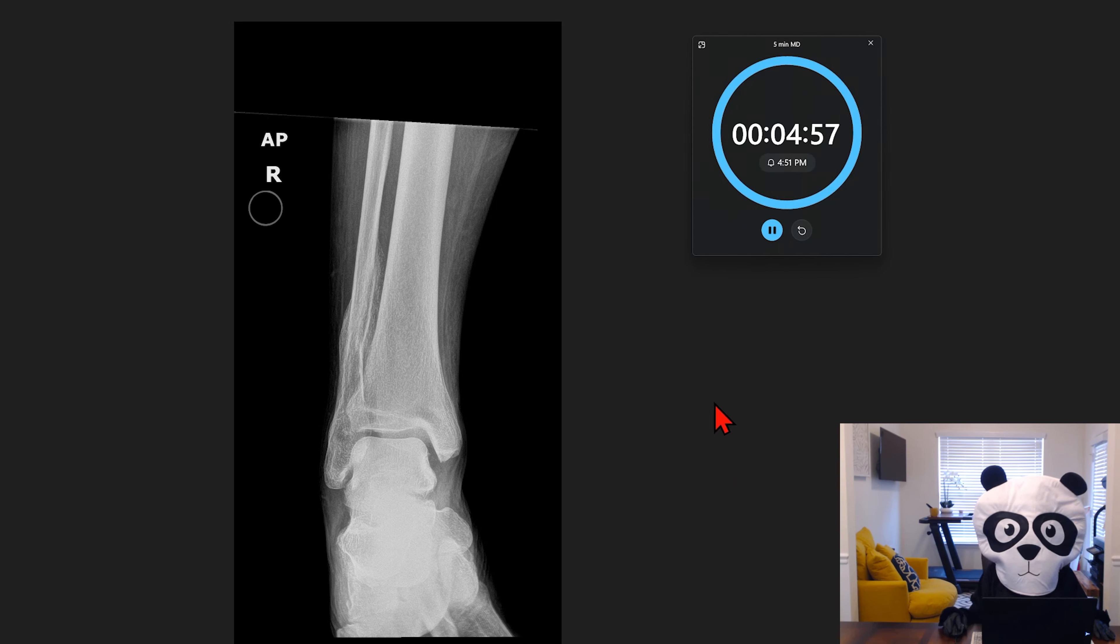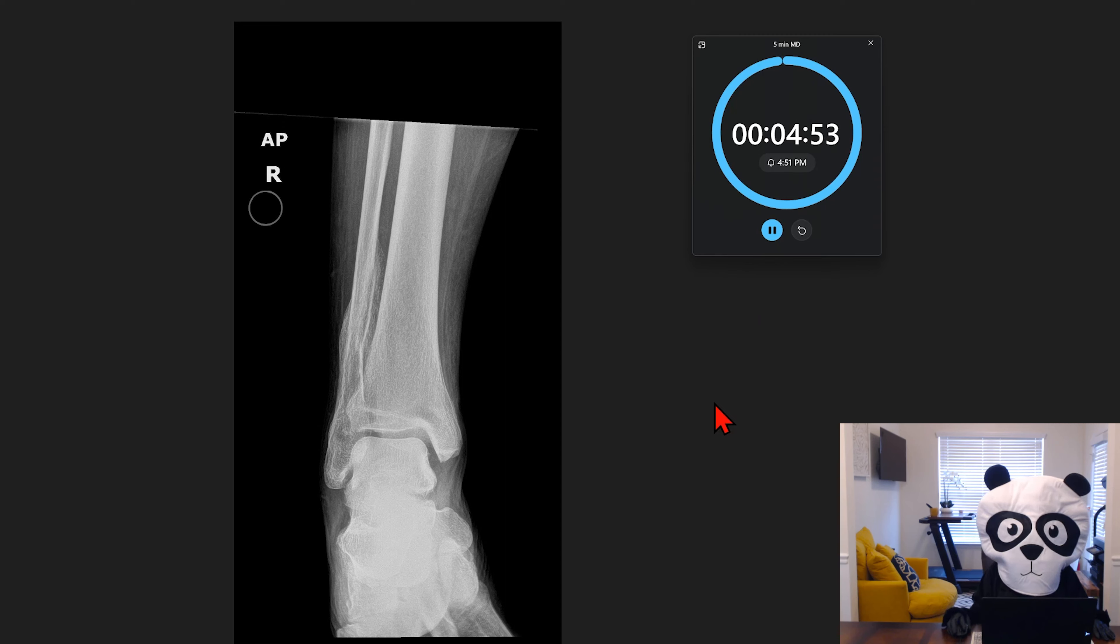So the backstory on this exam is this patient fell down a set of stairs and came in complaining of right ankle pain.